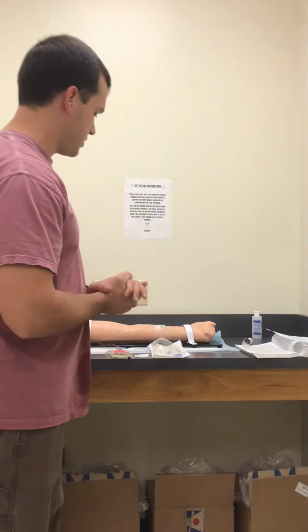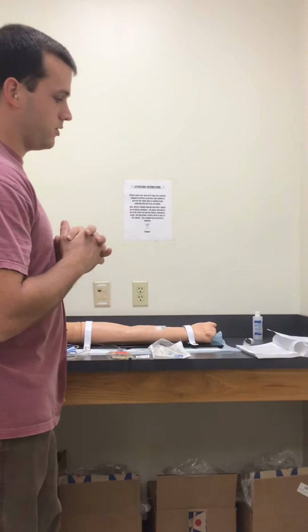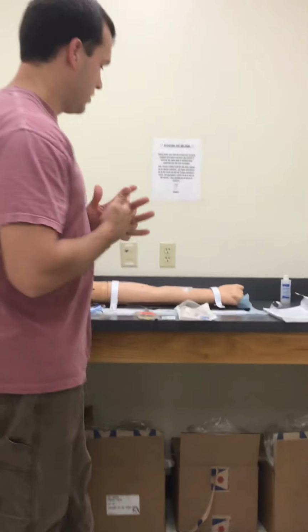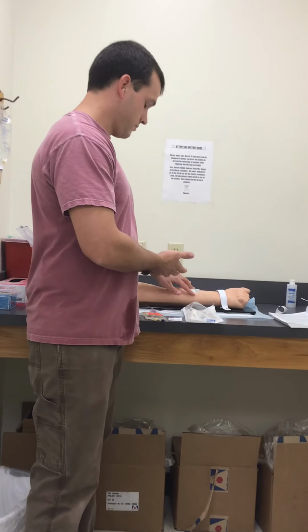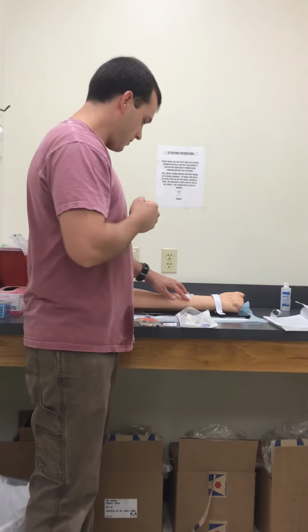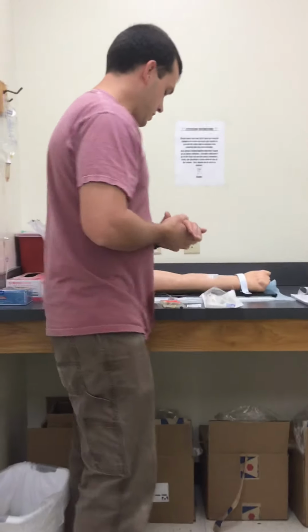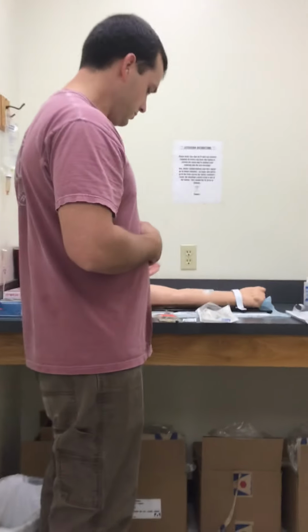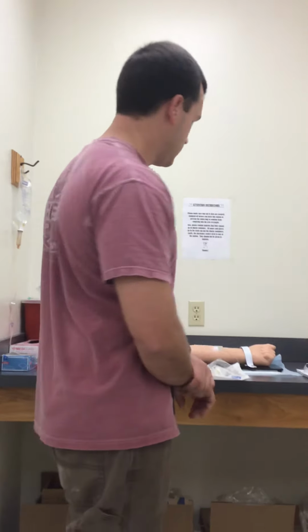Tell the patient that he will be receiving ceftriaxone, which is an antibiotic to hopefully take care of whatever infection he has at the time. Tell him that he will be receiving it via the IV site that he already has, so I will not have to stick him again. I can inspect the site, make sure there's no redness, swelling, or edema. Ask him if he has any allergies, and if he does, make sure that those allergies do not conflict with ceftriaxone.